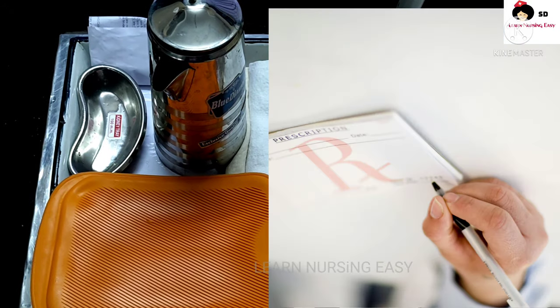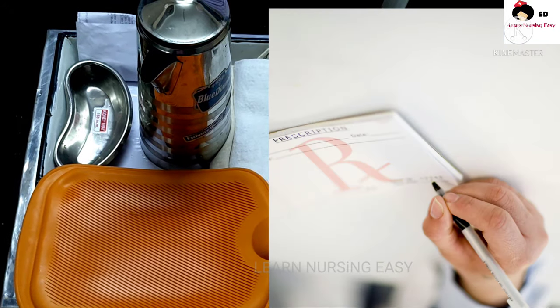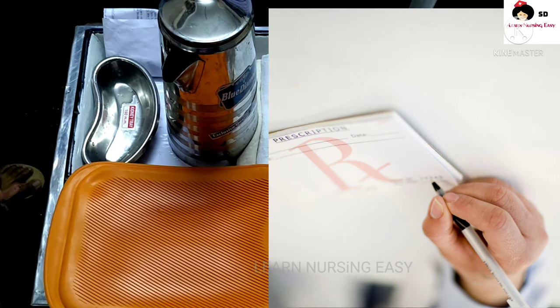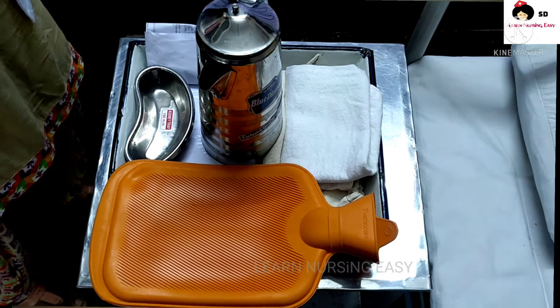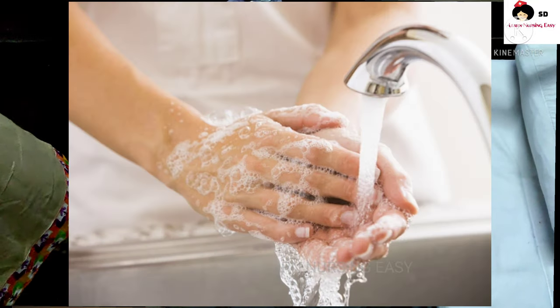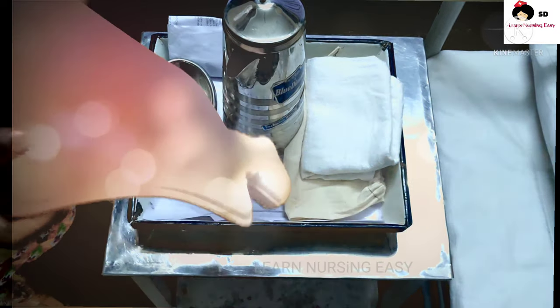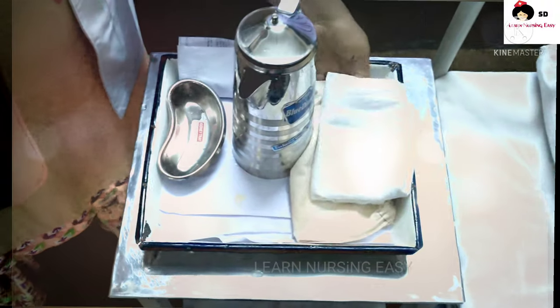Now coming to the procedure. Before doing the procedure, you must check the doctor's prescription — why the patient needs hot water application and on which area it should be applied. Do a preliminary assessment, wash your hands thoroughly, and prepare the articles. You will need a hot water bag to apply the hot water.